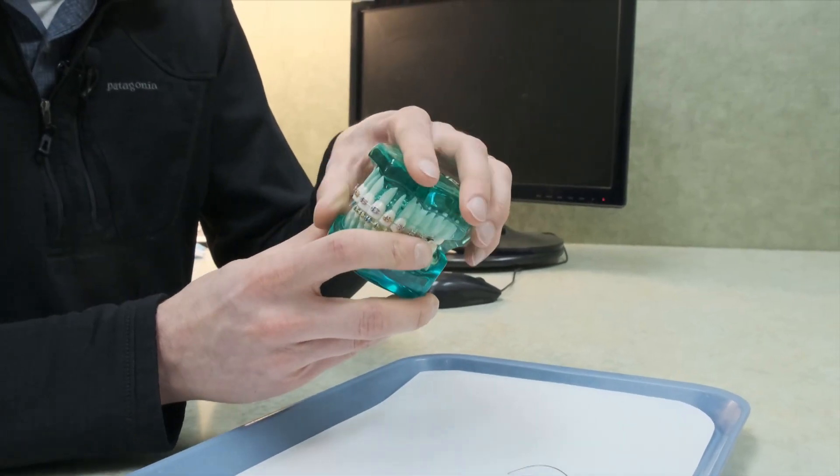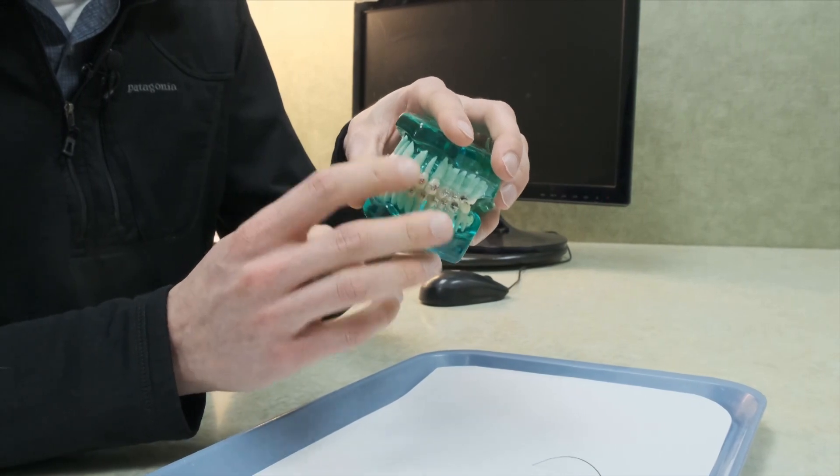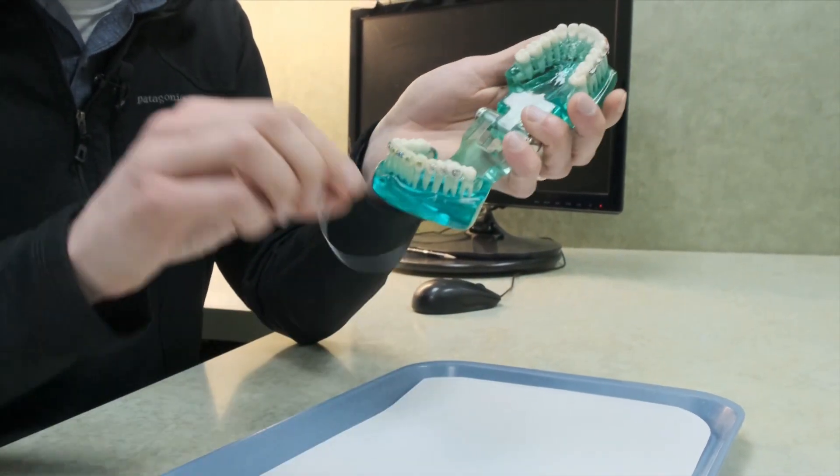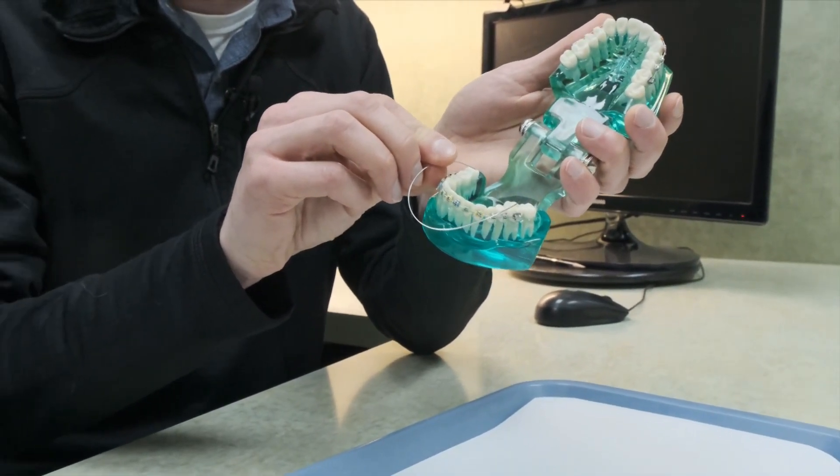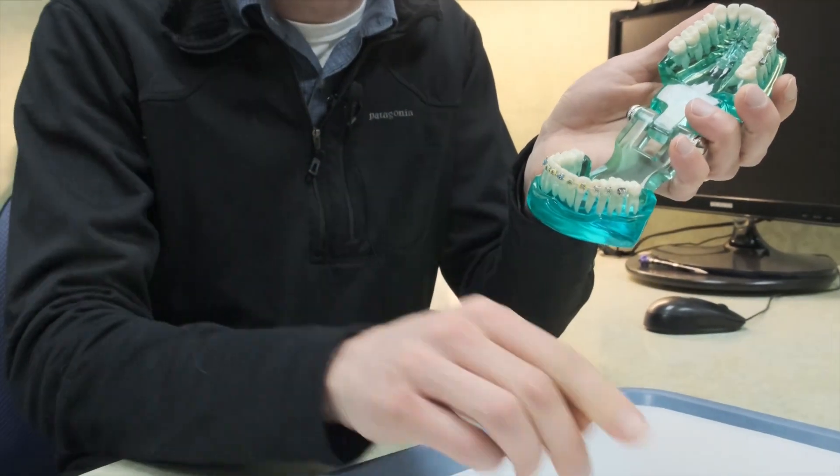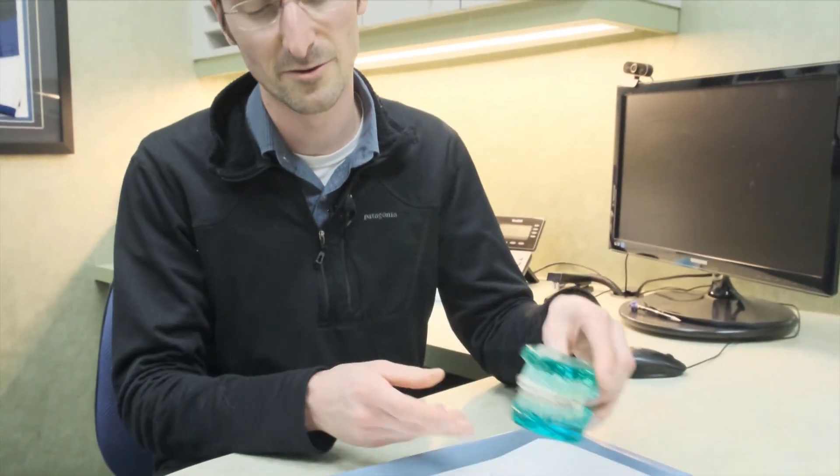Anytime somebody has a deep bite and their bottom teeth are being covered too much by the top teeth, and we're trying to flatten it out, we can put this wire in. That helps get our teeth lined up where we want them to be. That's called a reverse curve wire.